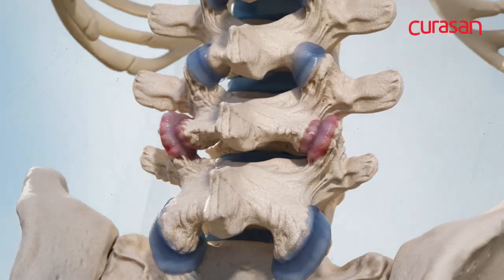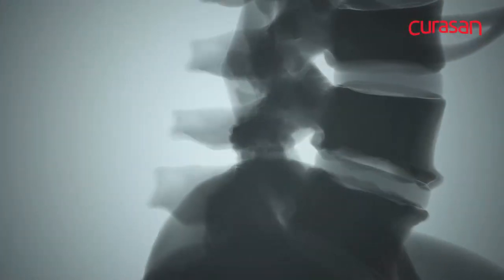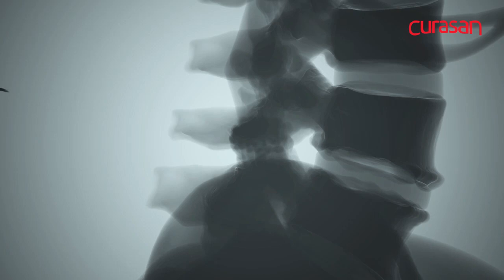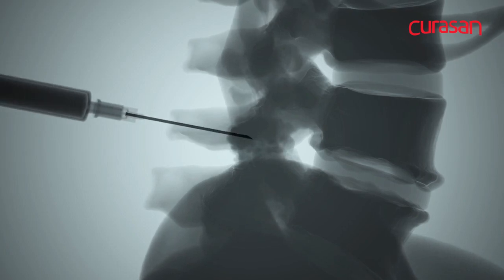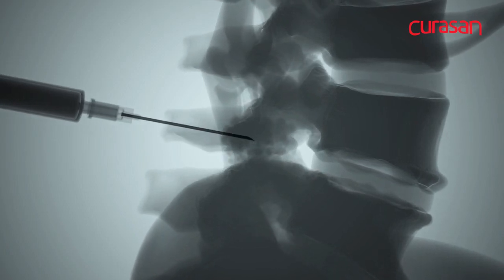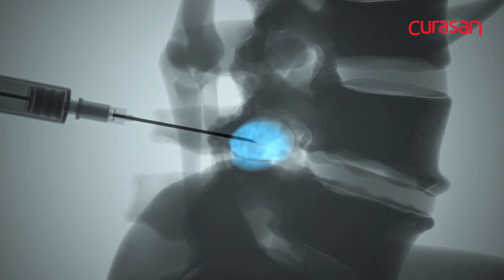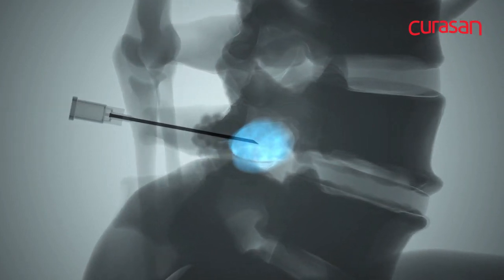A needle is then guided into the facet joints using fluoroscopy under aseptic conditions. Contrast dye can be injected to confirm that the needle is properly positioned into the facet joints.